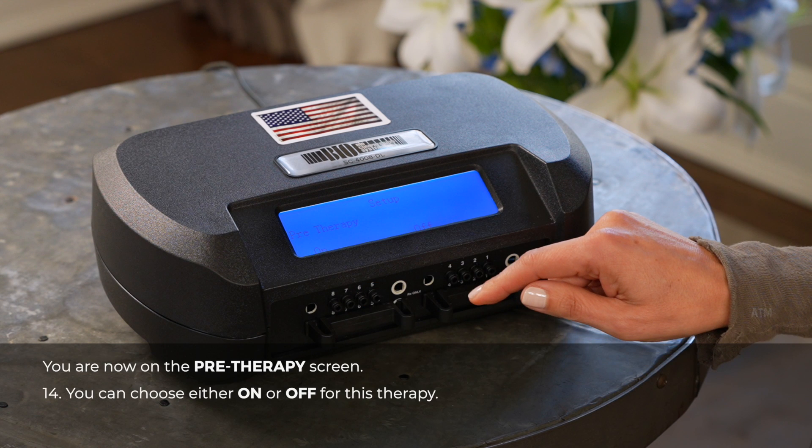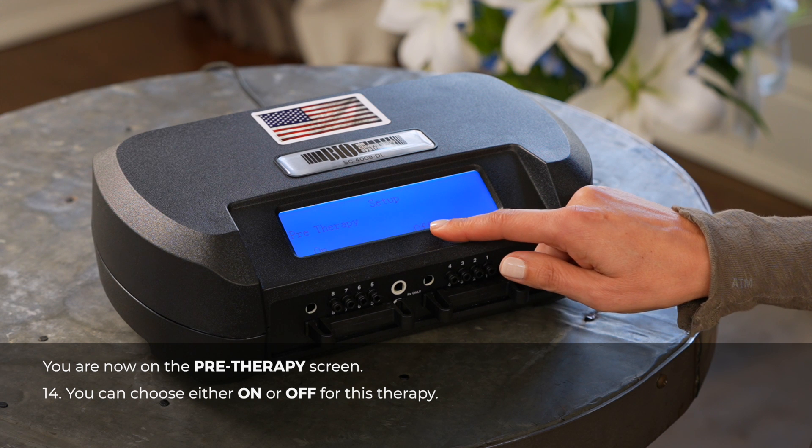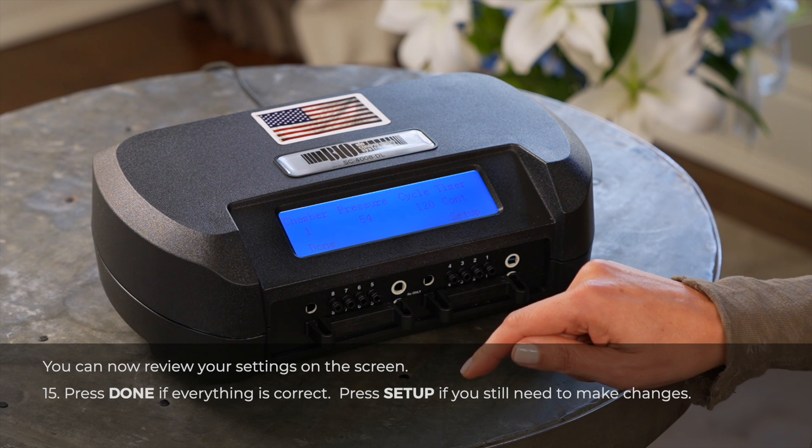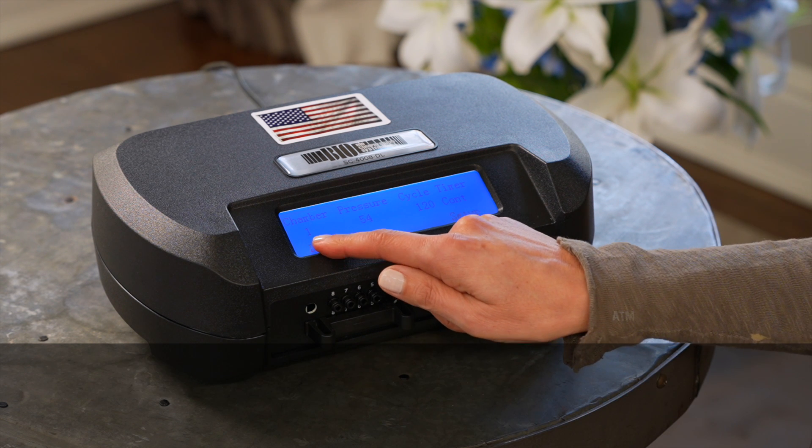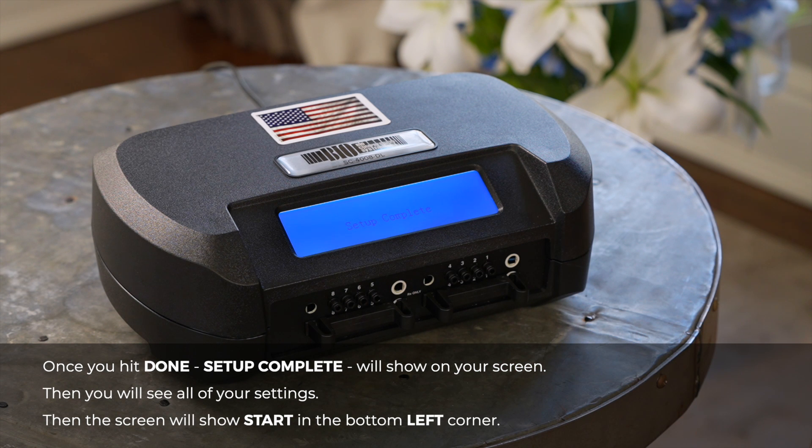You are now on the pre-therapy screen. You can choose either on or off for this therapy. You can now review the settings on the screen. Press done if everything is correct. Press setup if you still need to make changes. Once you hit done, setup complete will show on your screen. Then you will see all of your settings, and the screen will show start in the bottom left corner. Your pump is now set to your new settings.